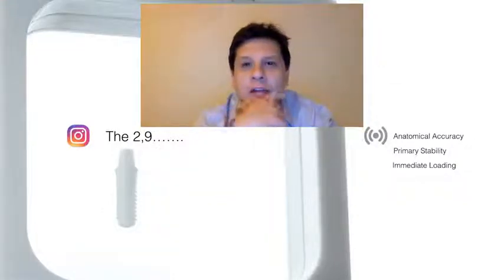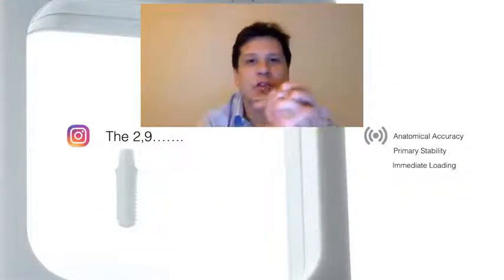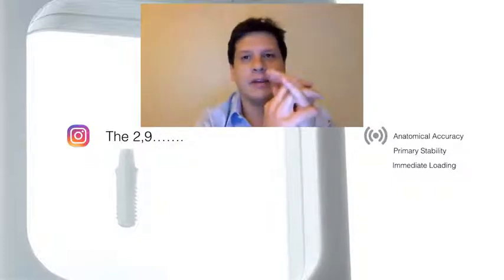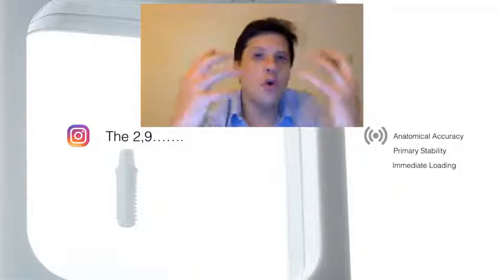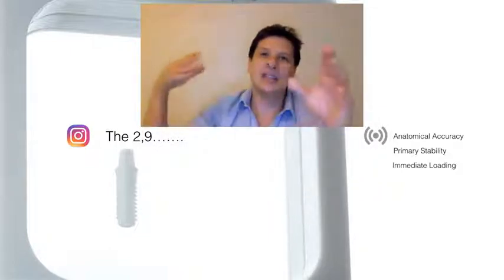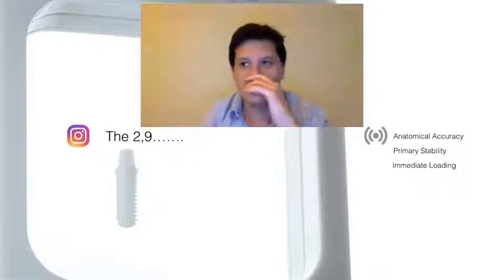So one of the things that I like very much with digital implantology is the possibility of being very accurate. That means that I already know where the bone is, and then I create a device, a surgical guide, that will lead me all the way through that situation.